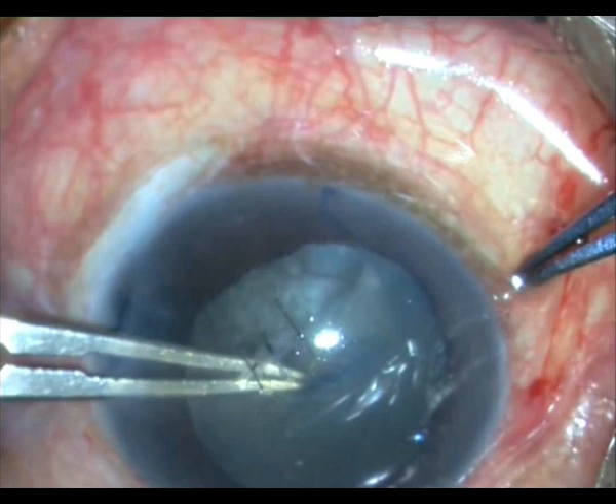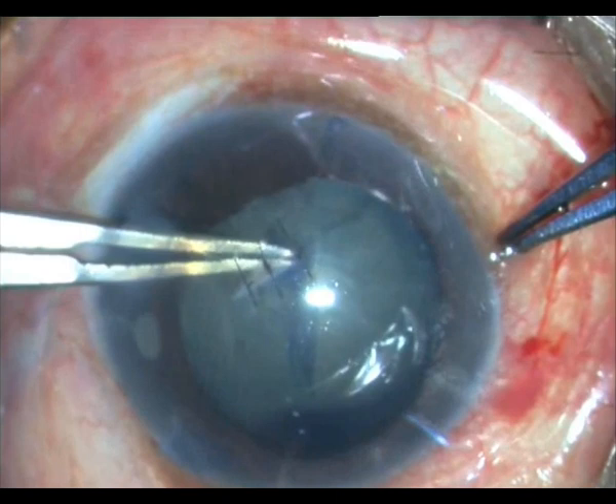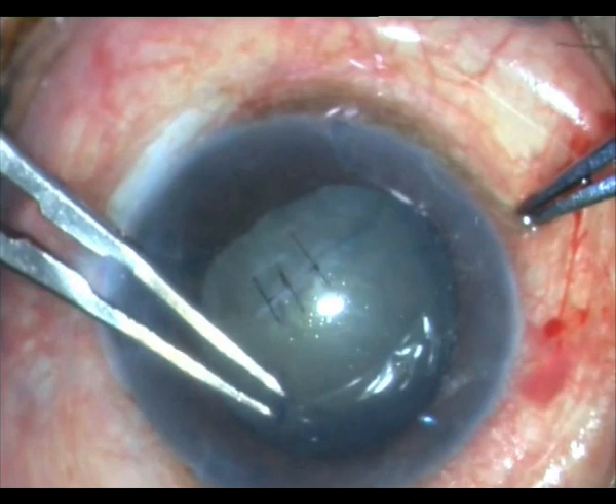It is a pretty large rhexis. It is an intumescent cataract, but luckily it is not that difficult to control this capsule. The flap has come off, so I just take it off, then re-hold the edge and go around — and it is almost a complete rhexis.